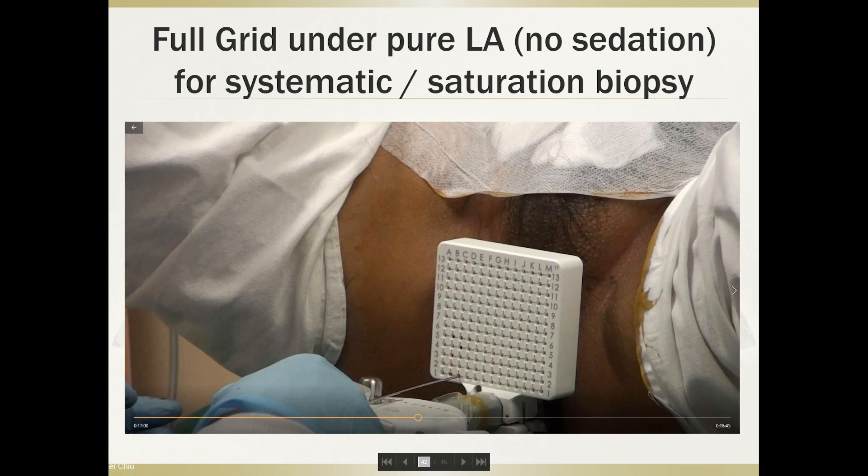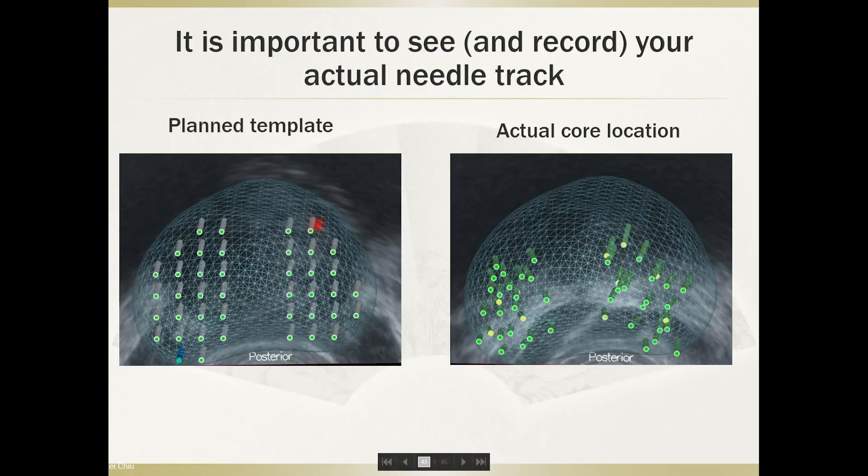We can also perform a full brachytherapy-grid systematic biopsy under pure local anesthesia, though to be frank this is more painful for the patient — tolerable, but more painful. What I want to highlight is that the planned template on a transperineal brachytherapy grid may not perfectly represent actual core locations. As you can see on the right, actual core positions can deviate significantly if the needle is not inserted attentively, which is very common in transperineal biopsy.